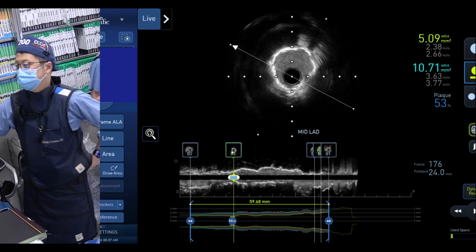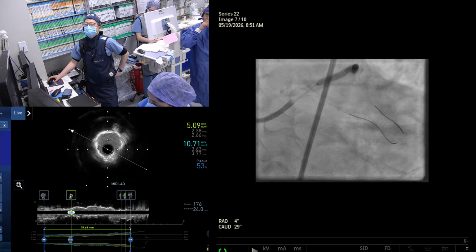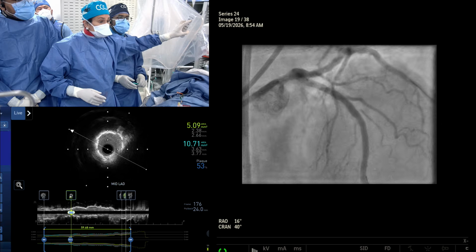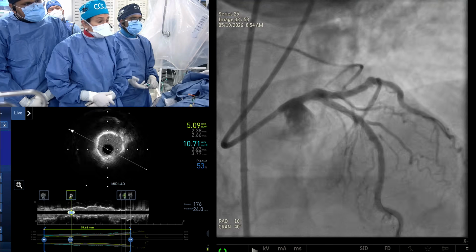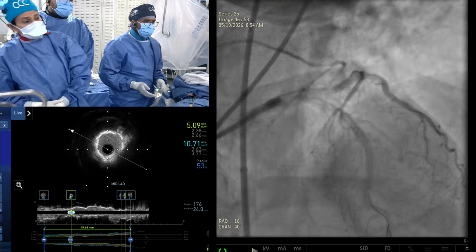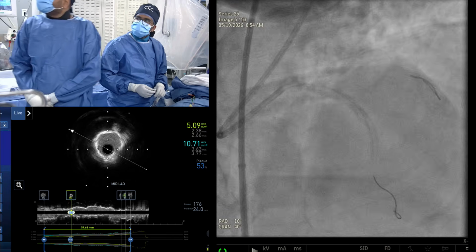Show the angiogram, please. Now, the distal reference was what? Okay, so there. Go here. Good. Outstanding. I mean that area after the septal, and just at the level of the diagonal. Angiographically, you also see it. There is a 20-30% narrowing.